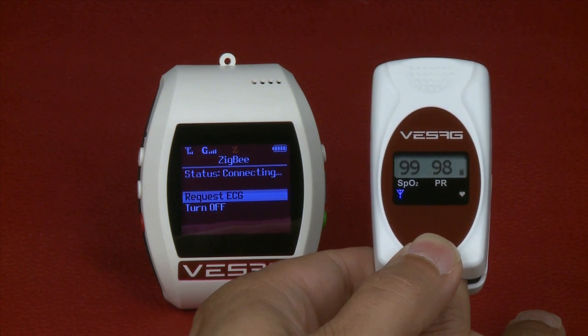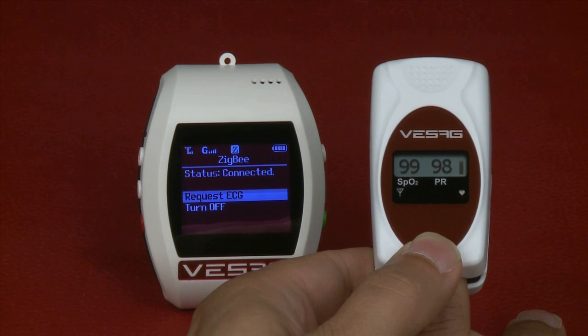The watch displays status connected in the Zigbee interface. The Pulse Oximeter data will be sent automatically to the server via Visag. The blue light in the Oximeter flashes when sending each set of data, indicating that the transmission of data is accurate.